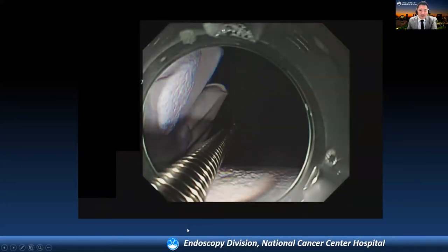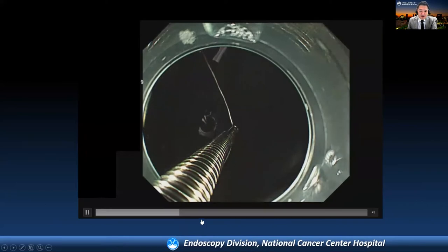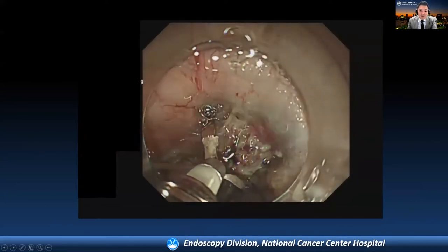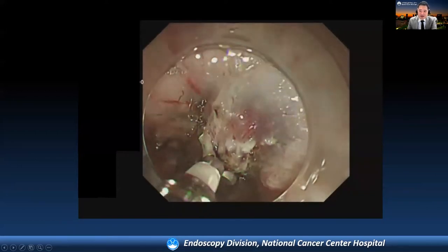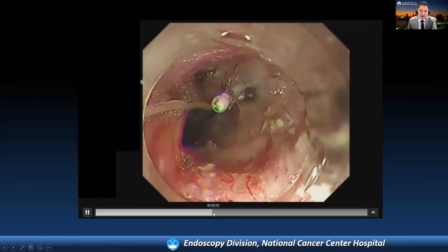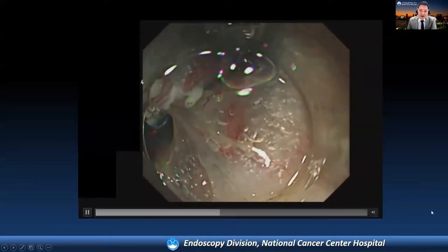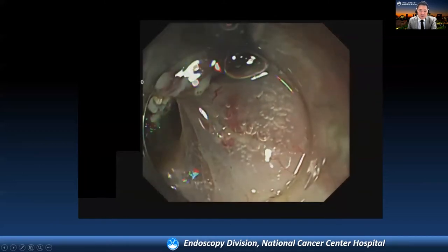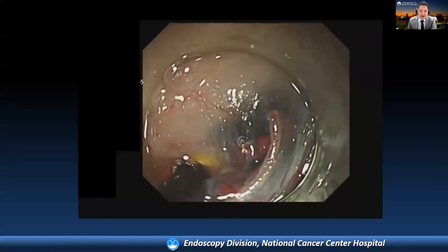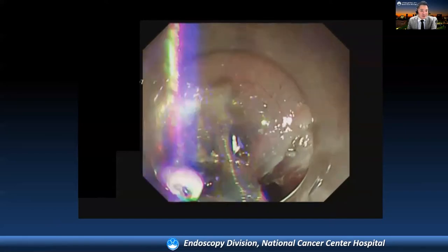We used the clip-line traction technique. A line was tied to the end clip outside the patient, then a clip with the line was introduced and deployed to the backside of the specimen. When the line was pulled through the mouth, the submucosal layer was well exposed and lifted up with satisfactory traction. This procedure allows us to perform easy and fast submucosal dissection.